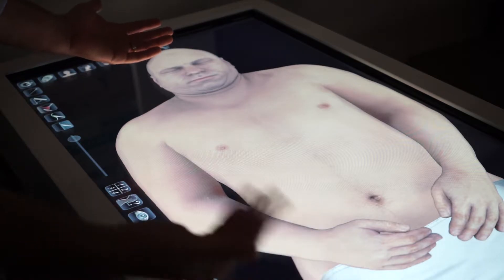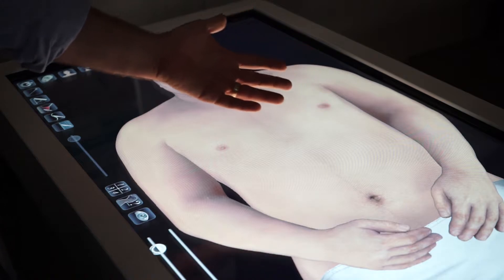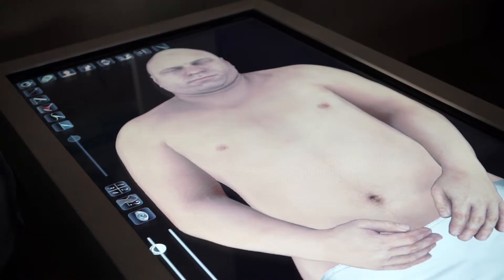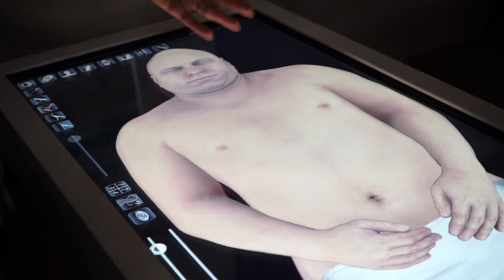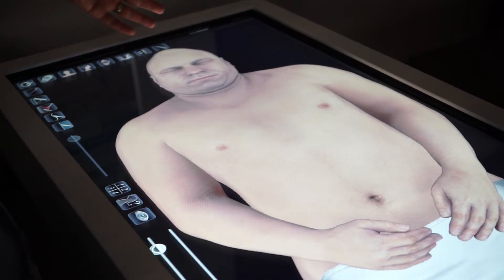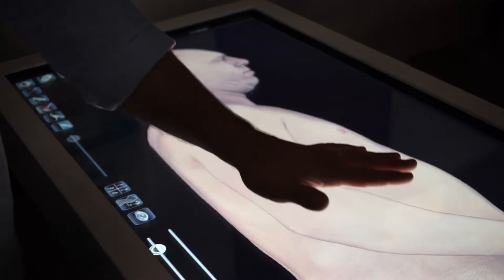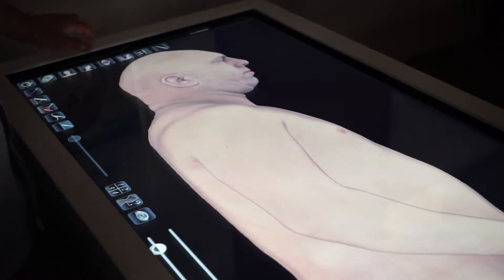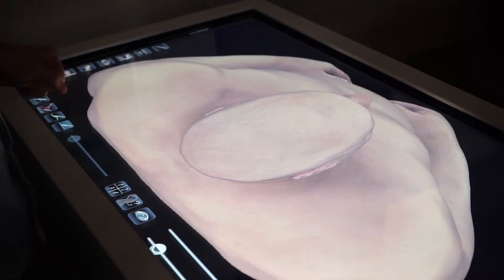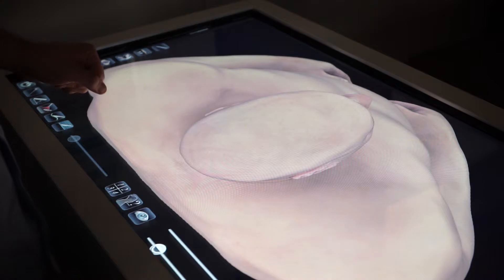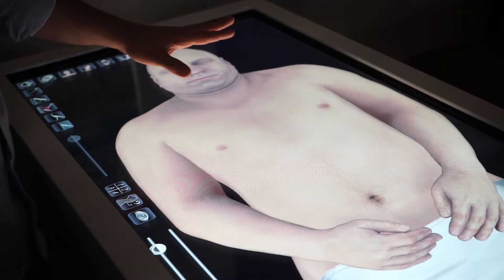We have a male model loaded for the table which we'll interact with now. You'll notice icons to the side which allow you to orient yourself. There's the front view of the model. You can see the model from a side view as well as a top view. Let's orient ourselves back to the front view and get started.